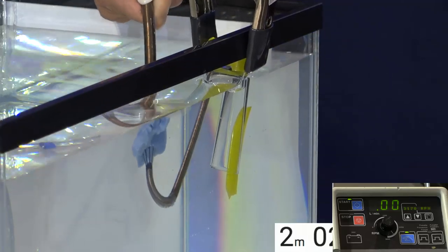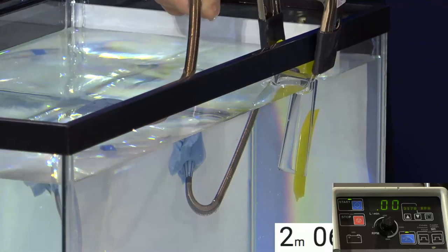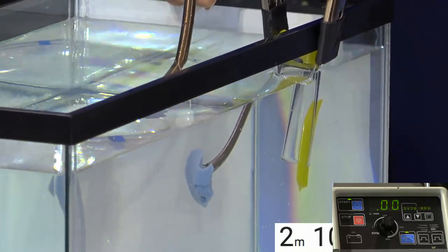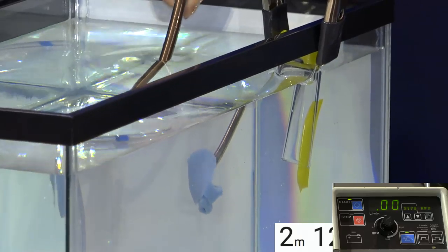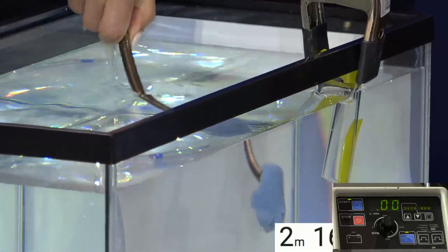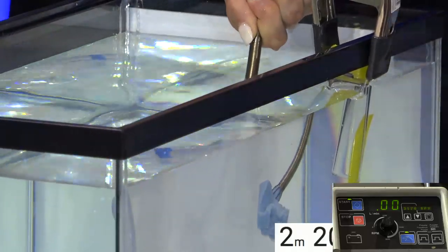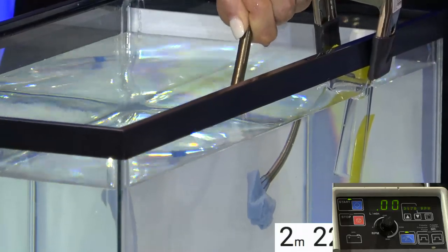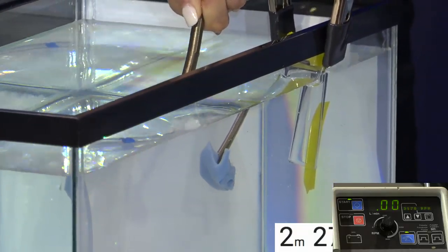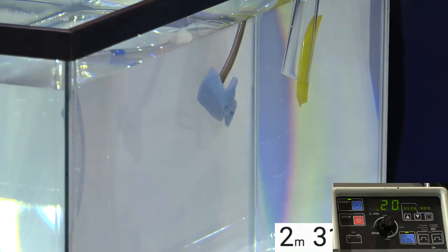What we're going to do is loosen the TUI on the back end, and retract the cannula just a little bit, just enough. If you can turn it so that they can see the tines of the funnel right there. A little more, other way. There you go. So if I back this in just a touch, see how it grabs a hold of it, reforms it, and then gives me a chance to go back in.